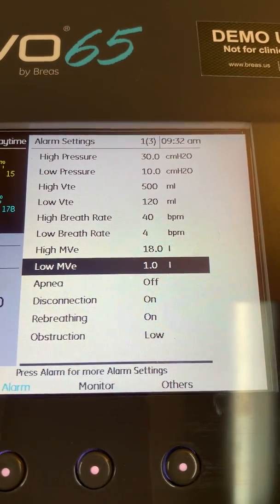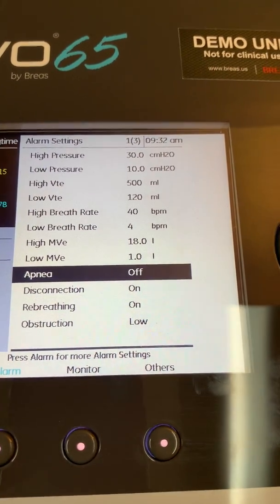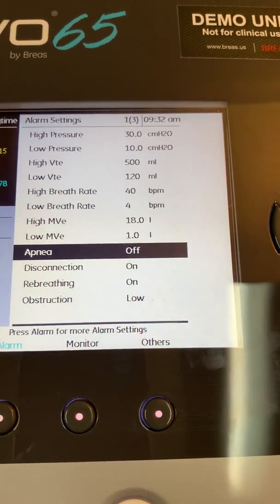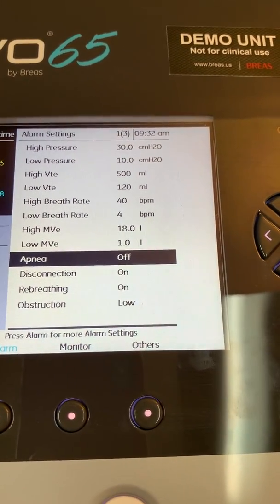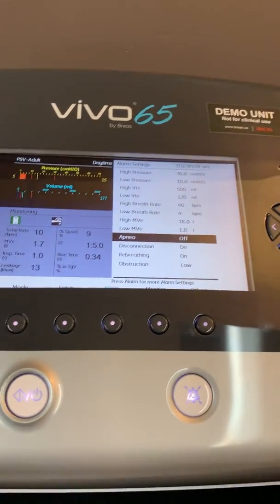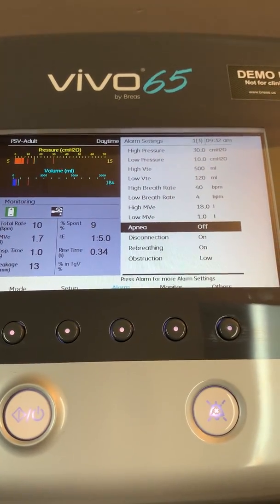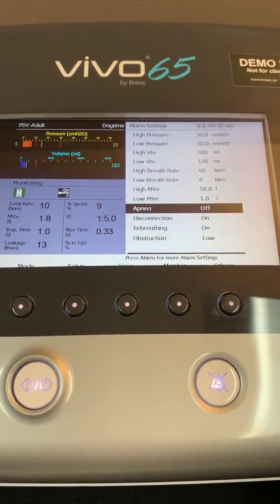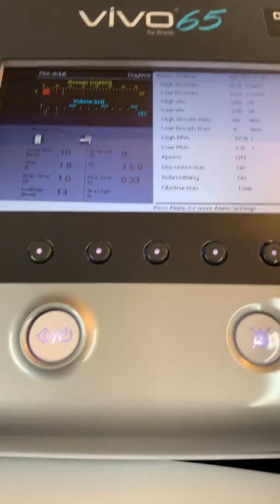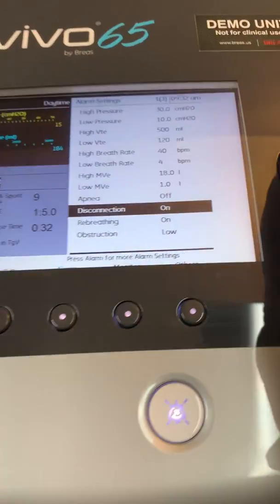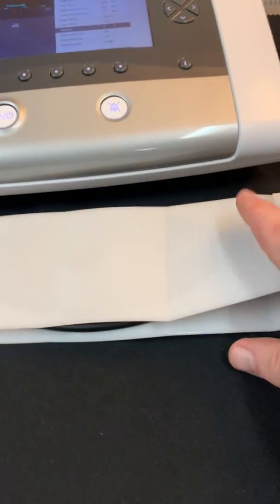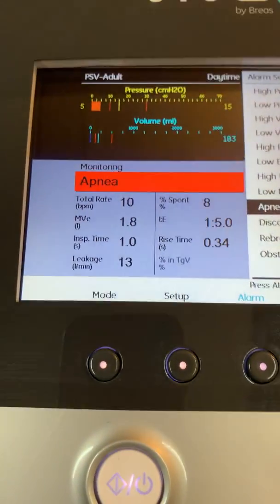A couple of key alarms I want to talk about: on the Vivo 65, the apnea alarm is associated with spontaneous effort. If the ventilator is not recognizing any spontaneous effort coming from the patient, then the apnea alarm is going to be activated. I currently have the apnea alarm turned off, but I'm going to change that to a setting of five seconds. If there's no spontaneous effort from the patient, I'm going to get an apnea alarm.